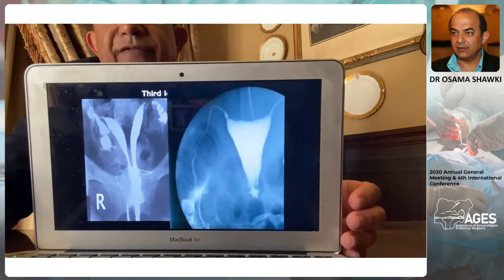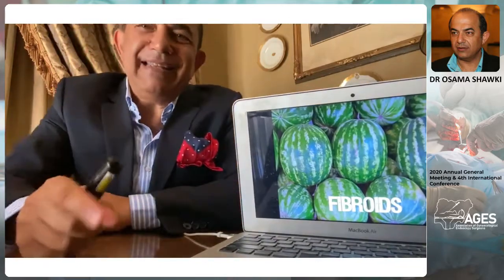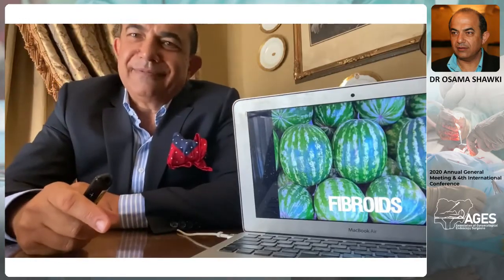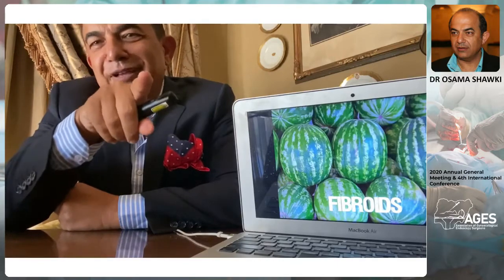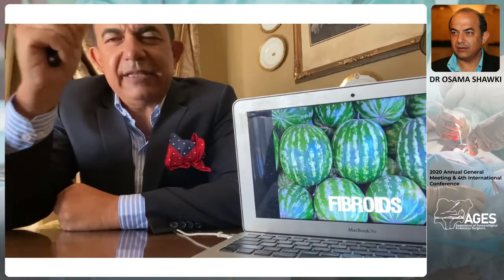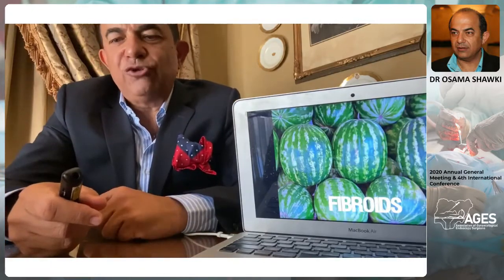Before and after. Again, I know it is exciting. Everybody wants to do it. It looks easy. And by the way, when things look very easy, actually it's not like that. This is a very important advice. When things look very easy for a beginner, when you watch others doing it and you think it's very easy, it actually hides a lot of skills in the hand that you have to learn.